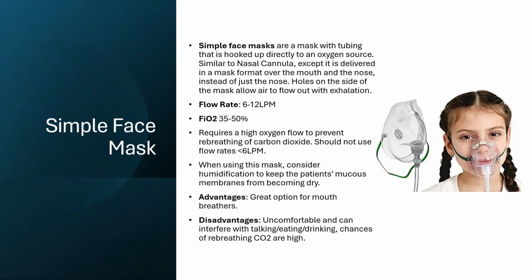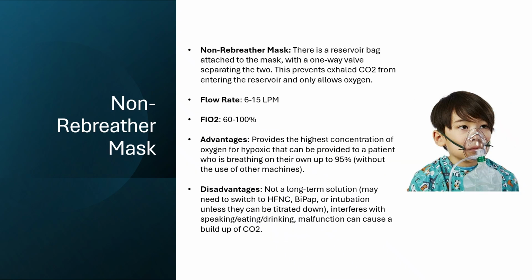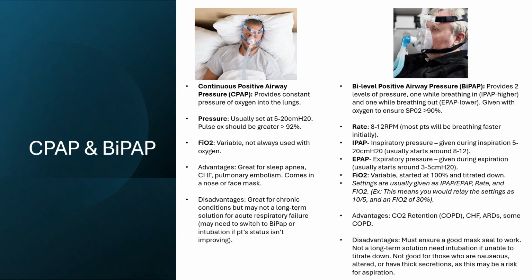Next up is the simple face mask. So a simple face mask is just a mask. Next up is the non-rebreather mask. It's very similar to the simple mask. Next up is CPAP and BiPAP.